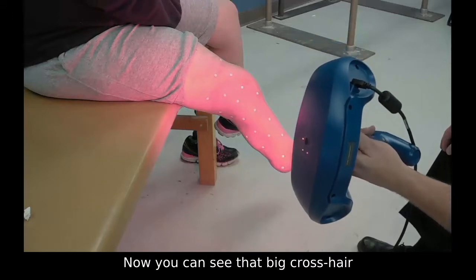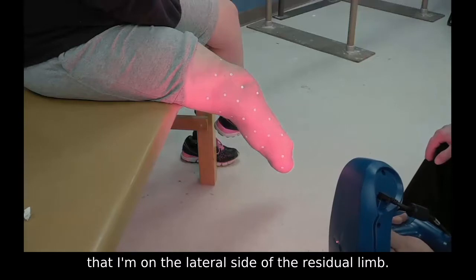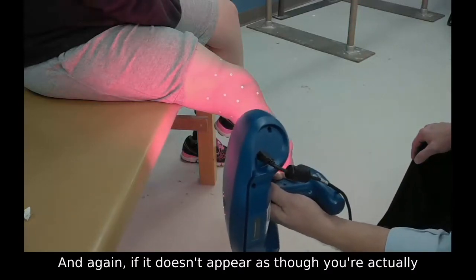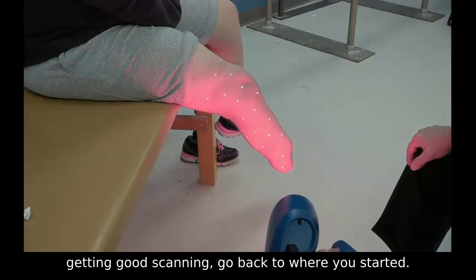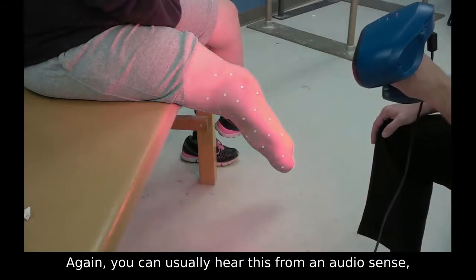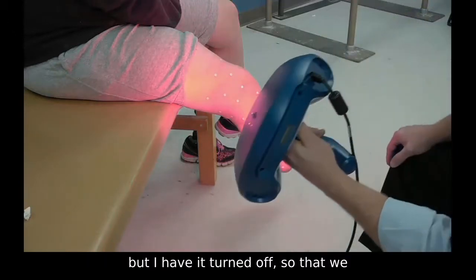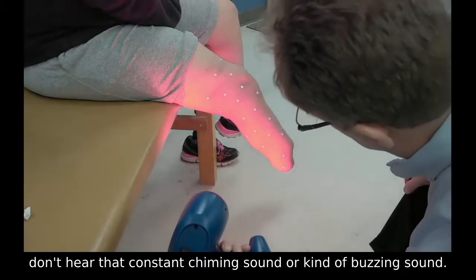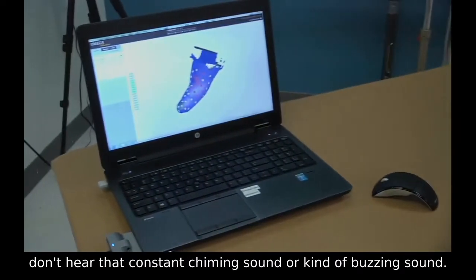Now you can see that big crosshair that I'm on the lateral side of the residual limb. But again, if it doesn't appear as though you're actually getting good scanning, go back to where you started. Usually you can hear this from an audio sense, but I have it turned off so that we don't hear that constant chiming or buzzing sound. Again, I'm going to go back.